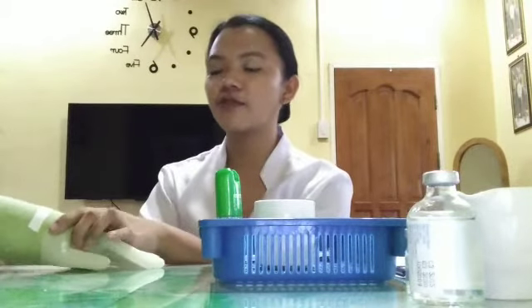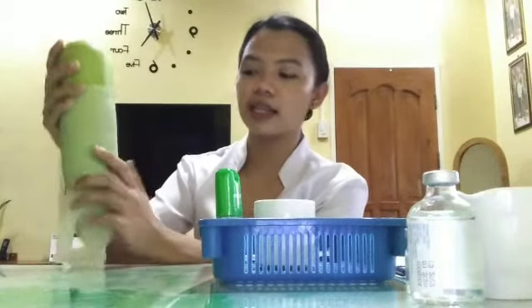So, I will be injecting on your deltoid muscle. You don't need to spend more time on it because maybe in 1 minute we will already have finished the intramuscular injection. So okay, she agreed to what I will be doing to her, and next we will identify the site. I will be checking the site.